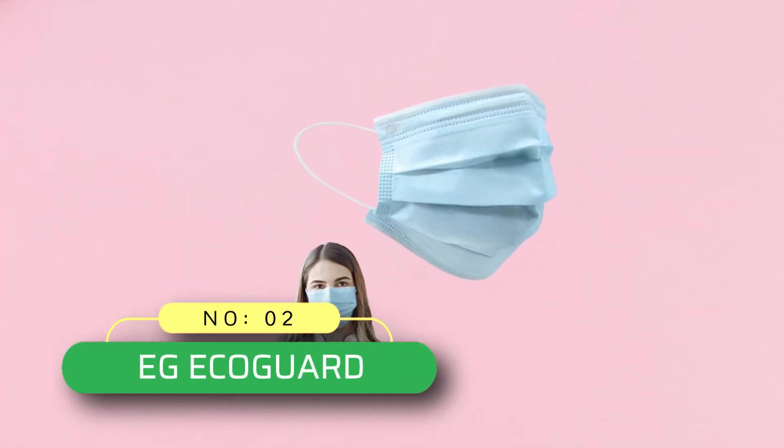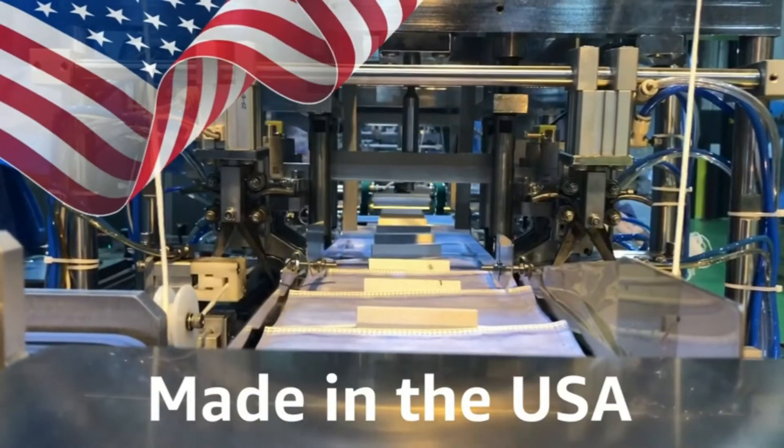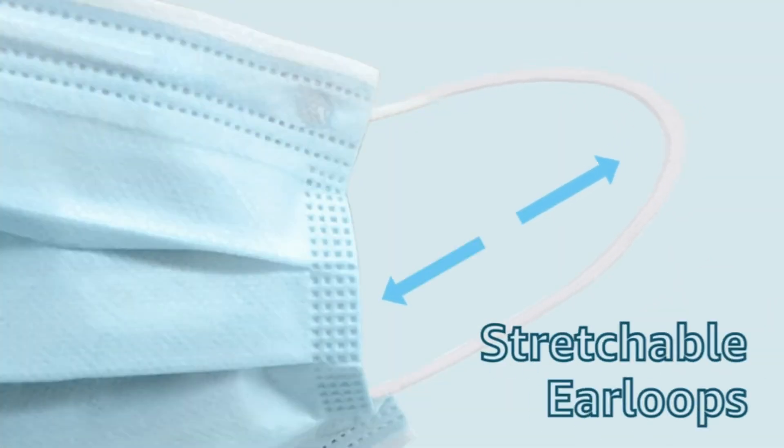Number 2: EG Ecoguard ASTM Level 3 Surgical Mask Made in USA. Polypropylene inner facing is the most popular material construction of our ear loop face mask due to the flexibility this design provides.